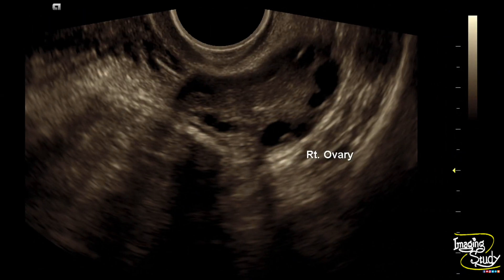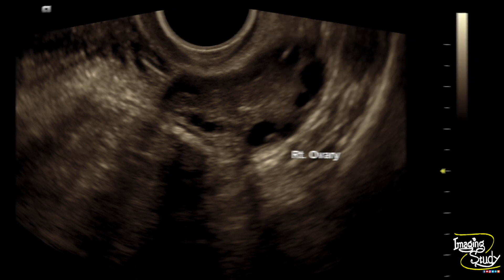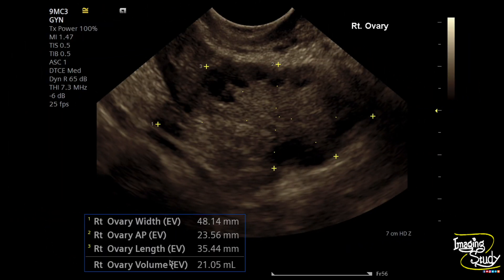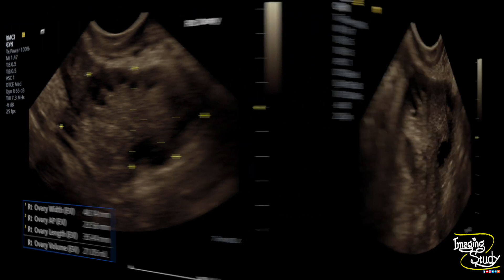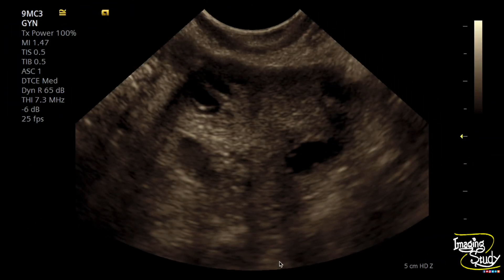You can see the ovarian stroma looks quite brighter. Here's the picture of the ovary and you can see this pearl string appearance with increased stromal echogenicity. We've measured the volume and it's around 21 cc. Again, no dominant follicle is seen at the time of scan.